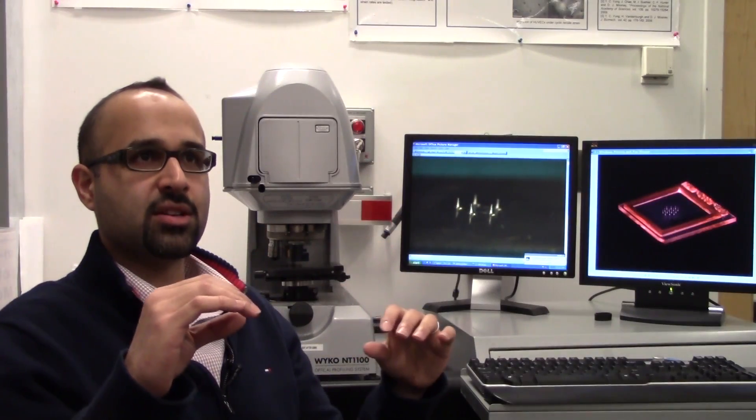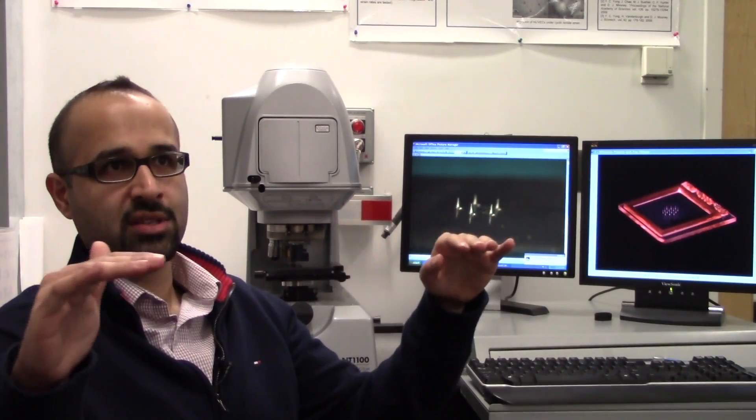In skin we have three layers. The outer layer which is the protective layer of stratum corneum, then we have the viable epidermis and then we have the dermis. So all the blood vessels and the nerves are in the dermis.